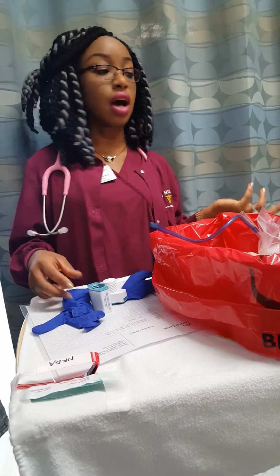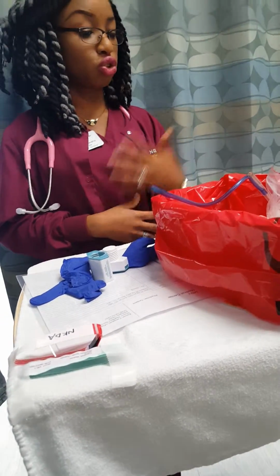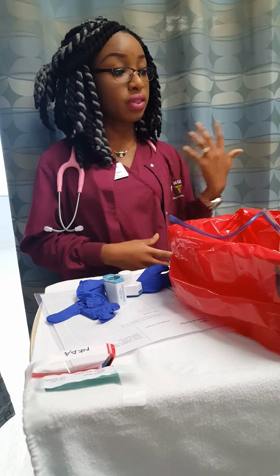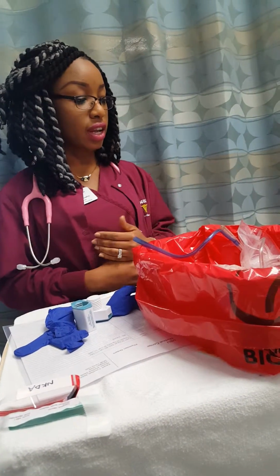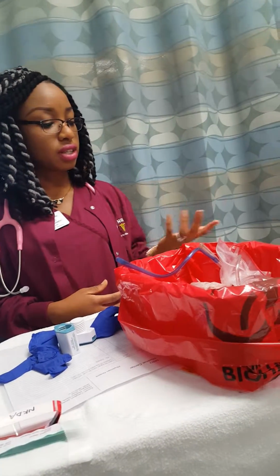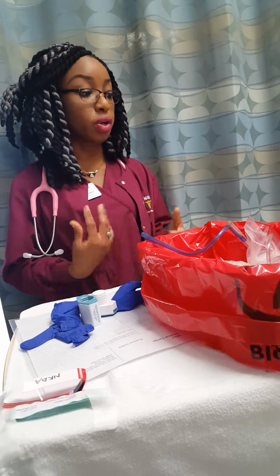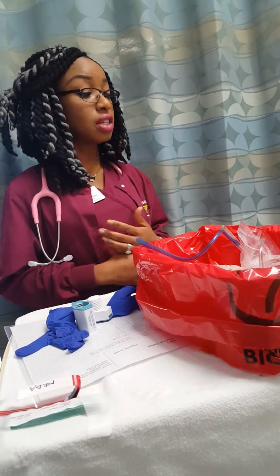and tell them what I will be doing. I will be giving you your medication through your nasogastric tube. Giving you Lasix, 20 milligram, and that's just for your edema, it's a diuretic, just to take away any excess fluid in your system. And I will be giving you Lotensin, and that is just an ACE inhibitor to lower your blood pressure, since according to your blood pressure, it's a little bit hypertensive.